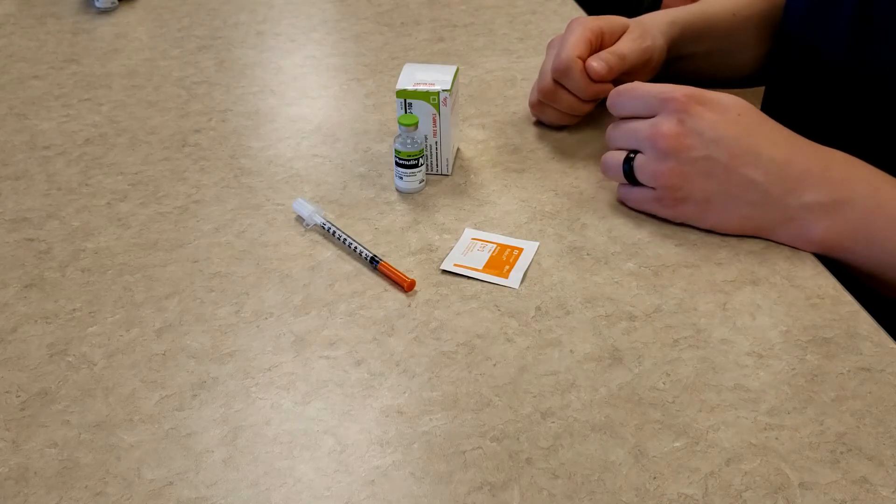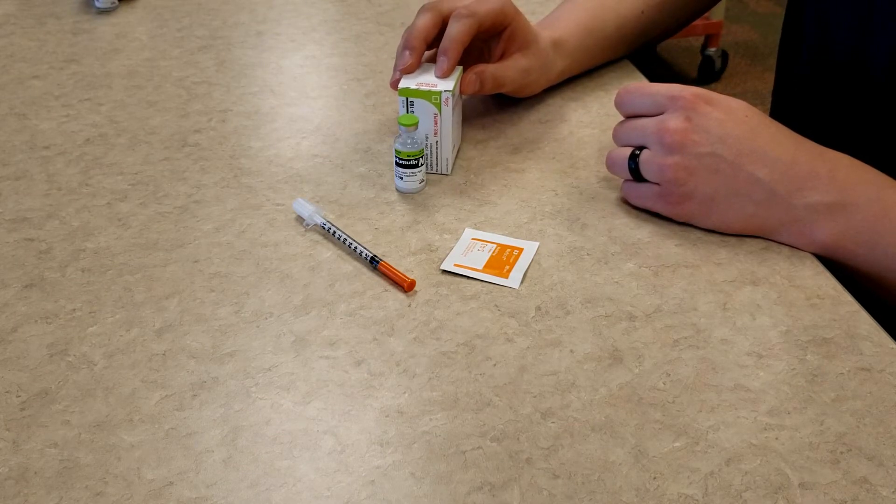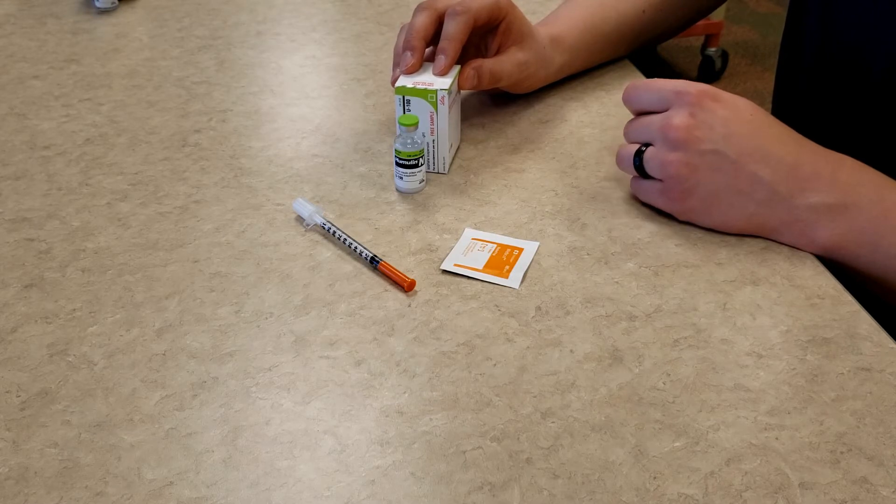Before I get started, I want to make sure that you have the correct supplies. The first item you need is the insulin. Do not start this process until you have clear instructions from your health care professional for taking your insulin. You need to know your exact prescription, which should include the type of insulin, the doses, and the specific time of day in which you are to be taking each prescribed dose.